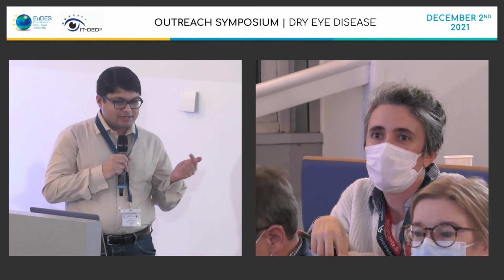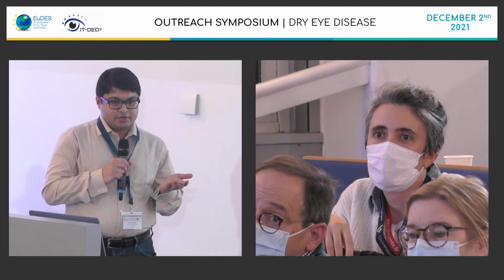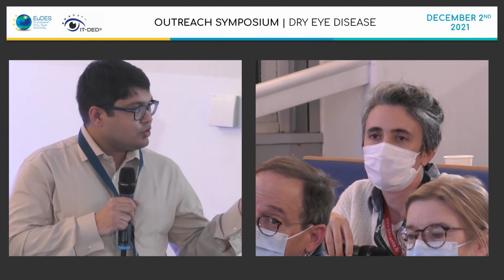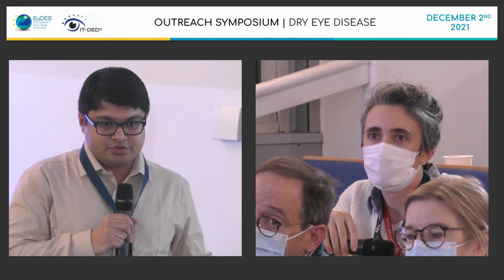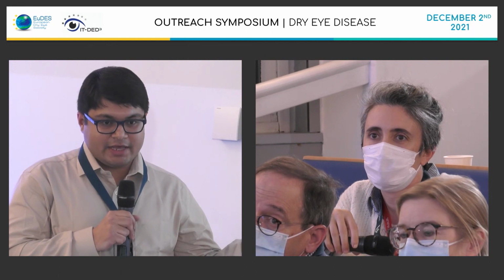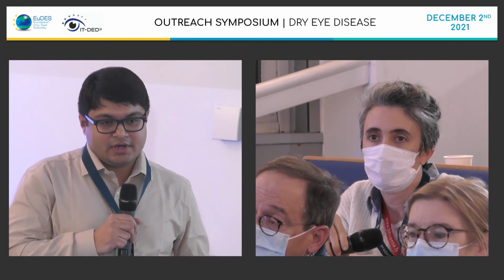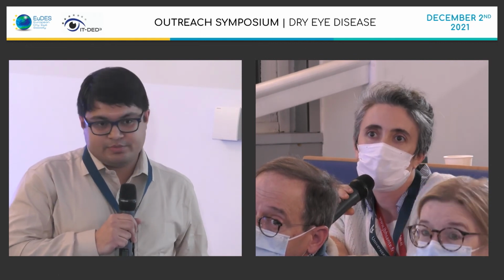From the HRT RCM, it provides a stack of images, though we collect only a slice, so we use only 2D. Maybe in the future we could use a three-dimensional AI model to predict the dendritic cells in the stack, in the volume of the images. But you didn't perform this? No, not yet.